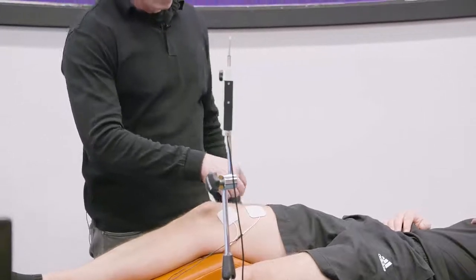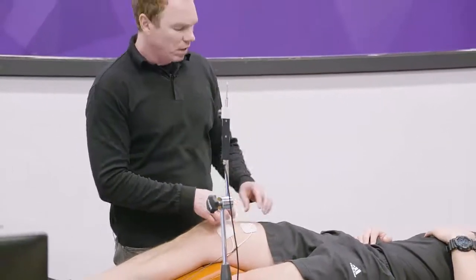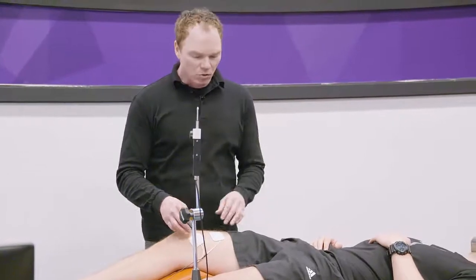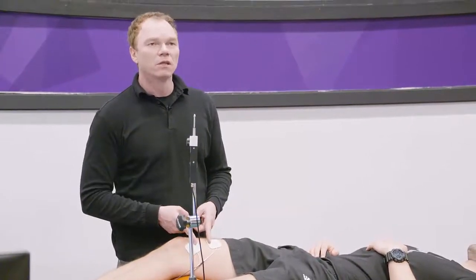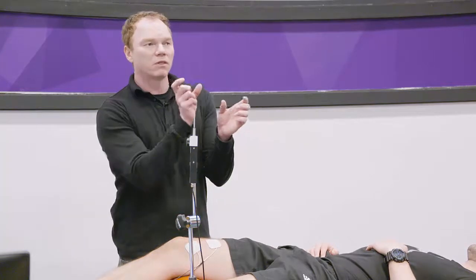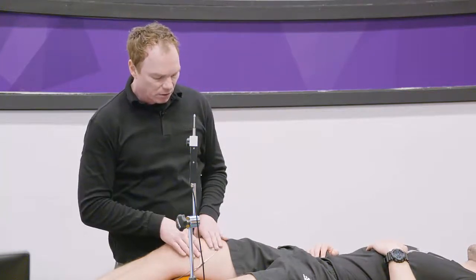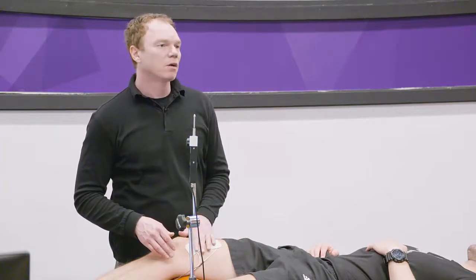Since these are not the only electrodes you have to use, in most cases the standard size — 50 by 50 millimeters — is used, and for most big muscles it's good enough. You need to leave enough room for the sensor to be positioned. If you have a long muscle like rectus femoris, you usually leave up to one electrode width of space — five centimeters — between the electrodes. This is about placement.